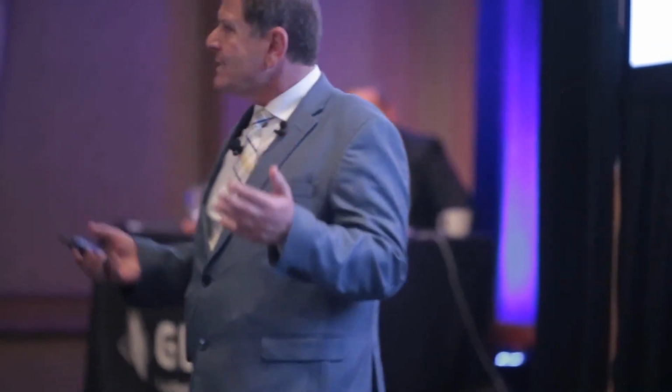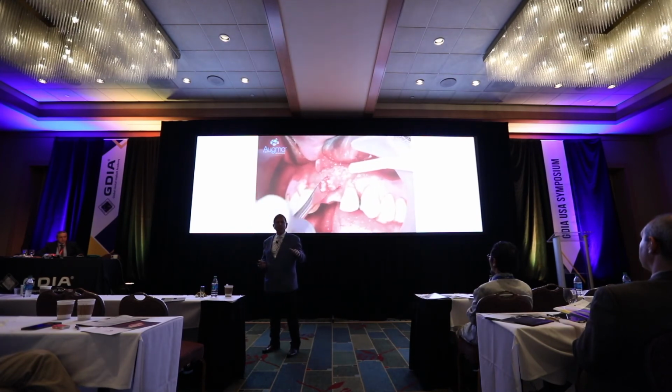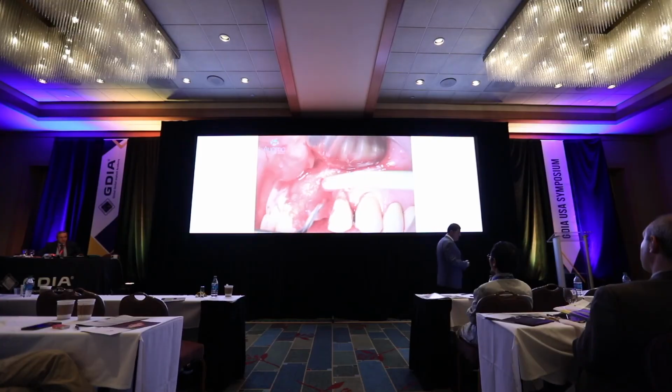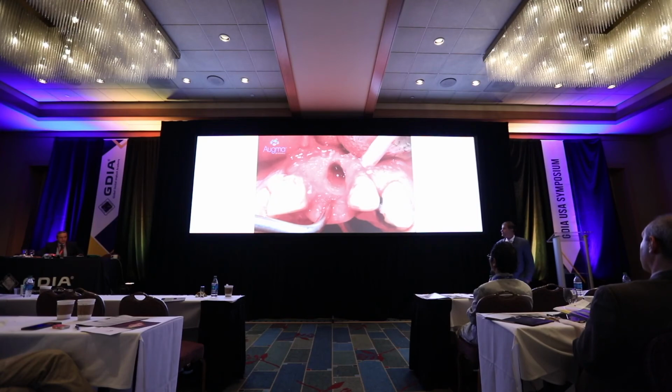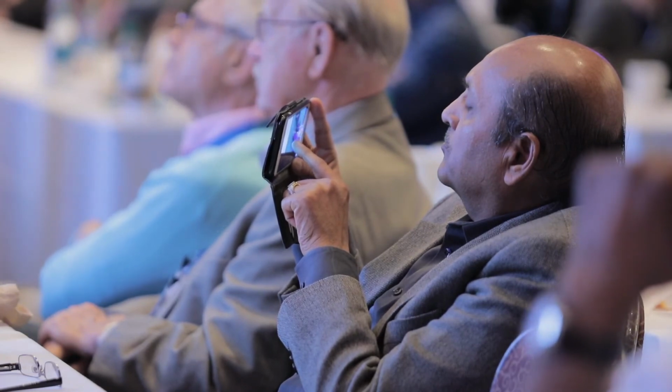Now, as you saw here, when you have a socket grafting and you don't reflect the flap, never leave it completely exposed, because then you will lose volume. Don't forget that the only time the material is hard is when you place it. It will never be hard like a stone, but it's very stable. It immediately starts the transformation, so then it will be softer. Therefore, it must be protected. You see, when we release the flap, it does not need to be tension-free, as we do with a membrane. Just release it at the bottom of the flap, I mean, in the connective tissue, and that will be enough.